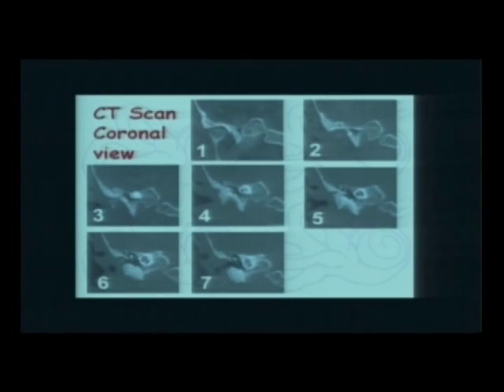And you find this tapered edge coming down, from which the pars flaccida is attached, part of the tympanic membrane, and they call that what? Shrapnel's membrane. Right. And this part of the bone is called what? The scutum. And very early cholesteatoma do what? They destroy the scutum. But we've always taken this as a sign on CT scan, but alas, it's not a proper sign, because sometimes cholesteatoma doesn't arise in this part of the tympanic membrane. It arises in the posterior superior part of the tympanic membrane without destruction of the what? Of the scutum. So a destroyed scutum is a good positive sign, but it's not a good what? Negative sign.